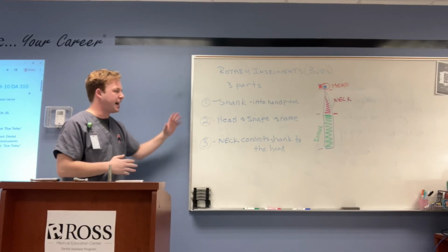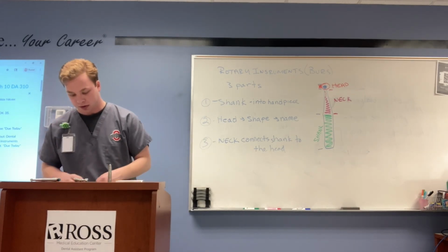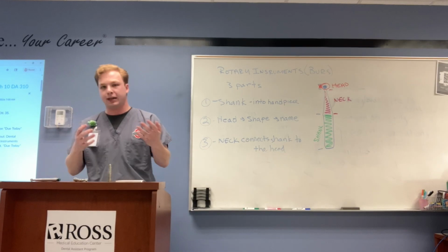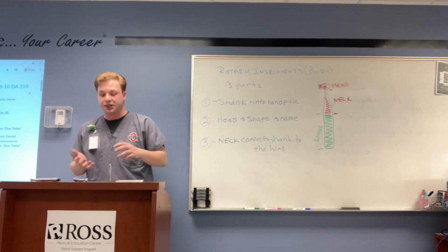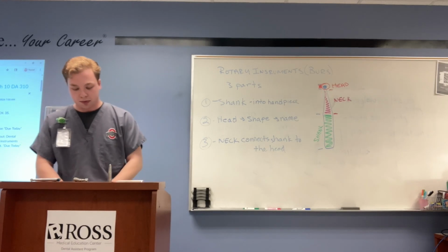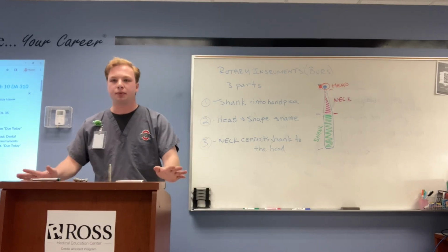So this is our basic anatomy of pretty much the majority of dental burs. But the final thing I want to talk about today are the 4 different types of burs that you'll see. So the first one, we have an example, we have diamond burs, we have finishing burs, we have abrasive burs or discs, and we have different accessories to those, and we have some laboratory burs as well. So the first one I want to talk about is a diamond bur. Now, diamond burs are very expensive.